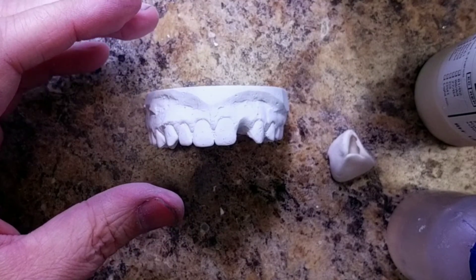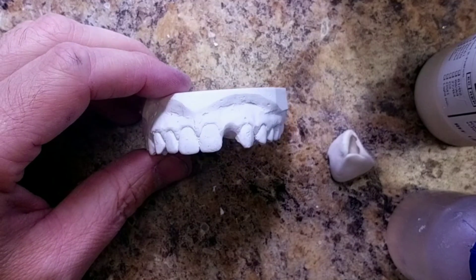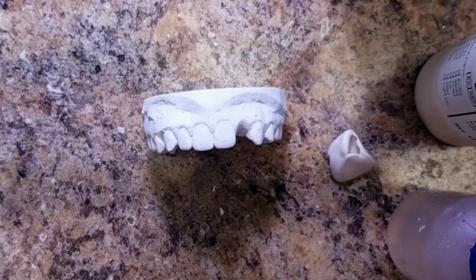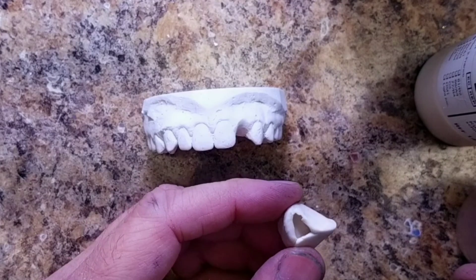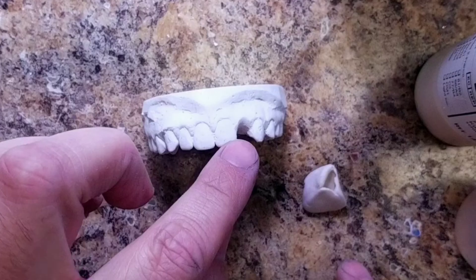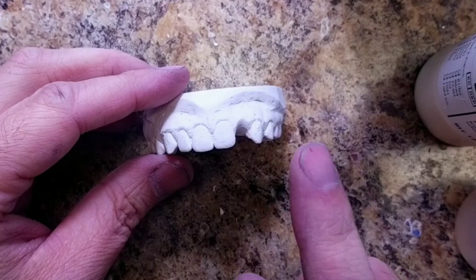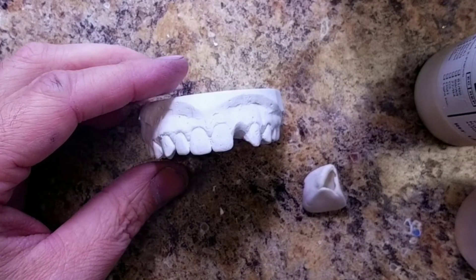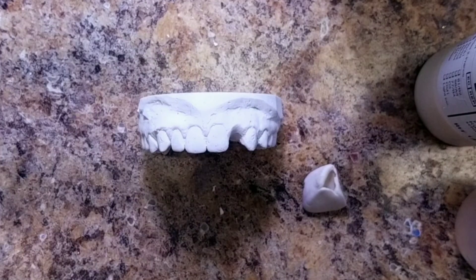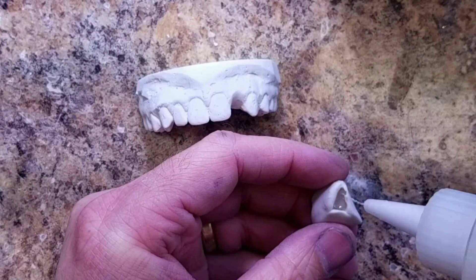Here's this week's challenge: a patient walks in and they're missing a tooth, and guess what — you don't have a tooth. In this video I'm going to teach you a little bit of a secret on how you can solve this problem. I simply took Faye's advice and made a duplicate of an old lateral pontic tooth. In this video I'm challenging myself to make and pour up a tooth, place it into the retainer, set the tooth, shoot the invisible acrylic down on it, and make an invisible retainer — all in a couple of minutes.